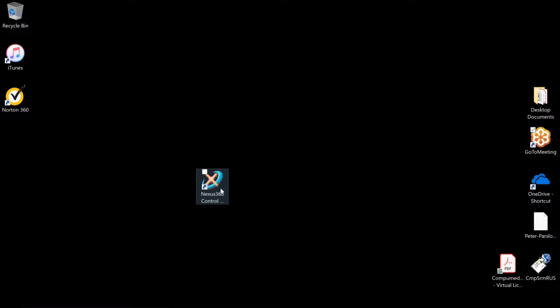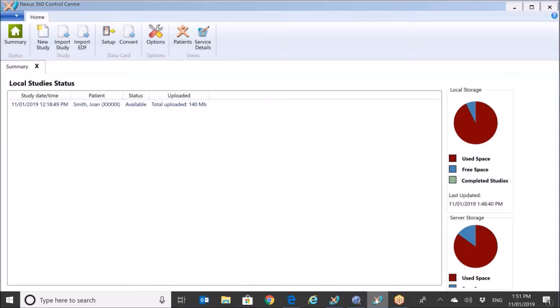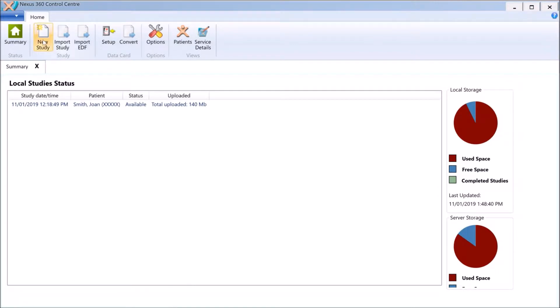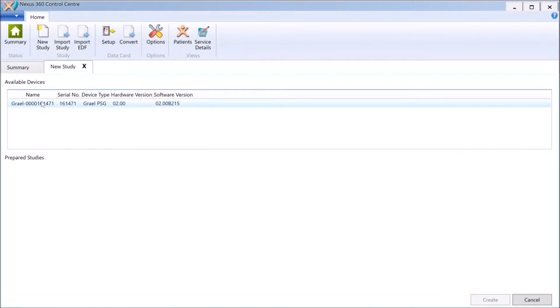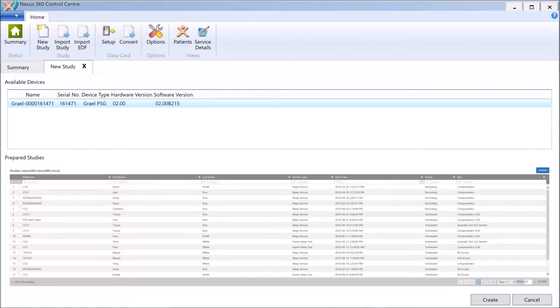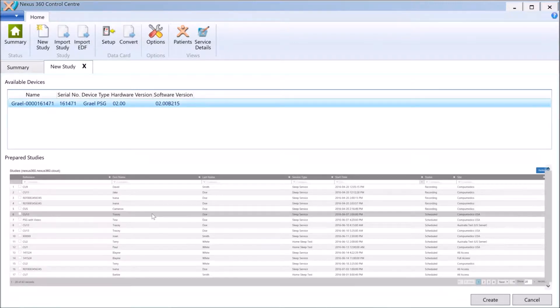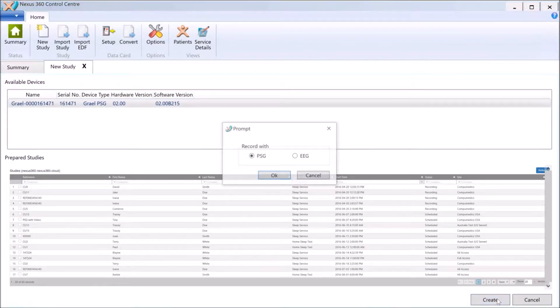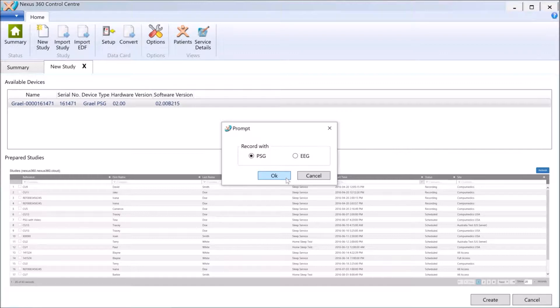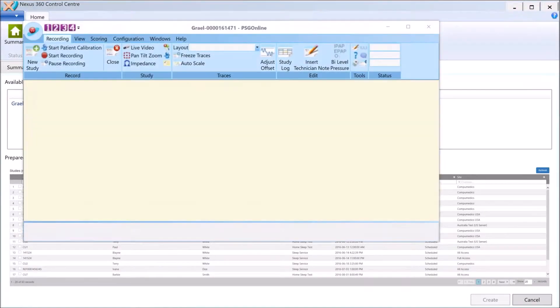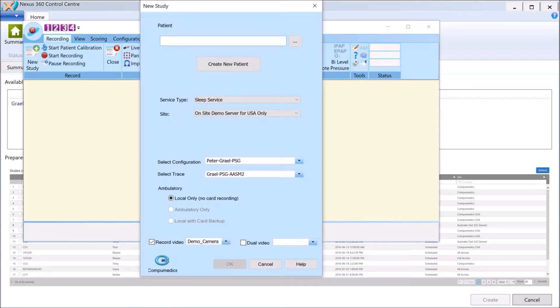We'll go into the acquisition machine — the Nexus 360 Control Center — and select New Study. We'll select the device we're going to record to. You'll see it lists up some prepared studies. I'm going to select Create from the bottom right, and it gives me the choice of which program to record with. Today we're looking at Profusion PSG, so we'll open PSG Online to record a sleep study.